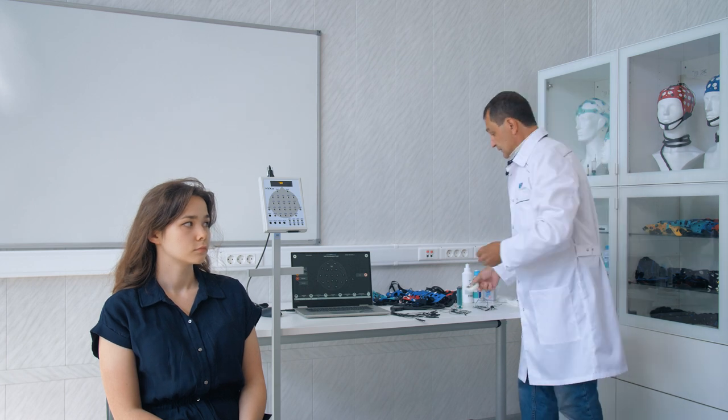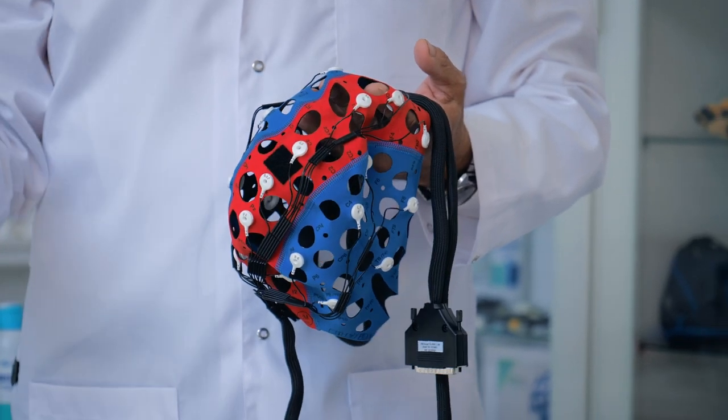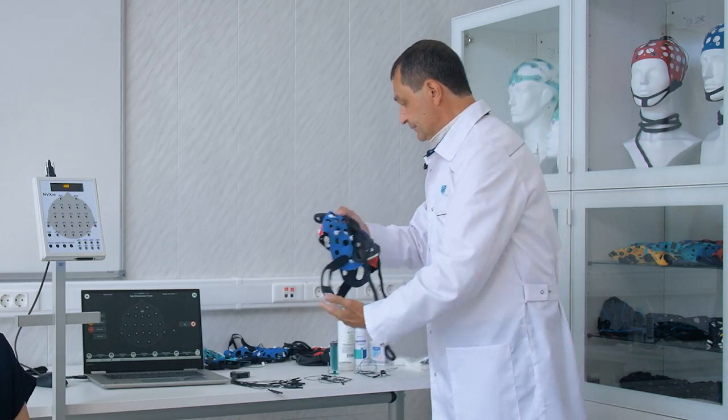In accordance with this, we select a cap that is the correct size. It should not be too big and not too small, but rather just the right fit. A small cap can tear or create discomfort. A large cap will not provide the necessary tension and, accordingly, the necessary fit of the electrodes and the corresponding contact. When putting it on, we must ensure to do so carefully, without making any sudden movements.